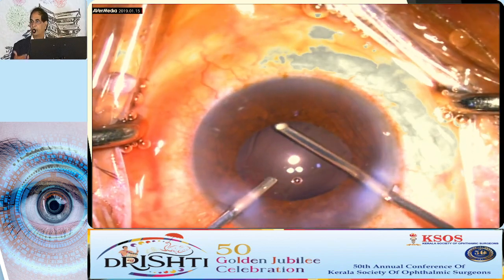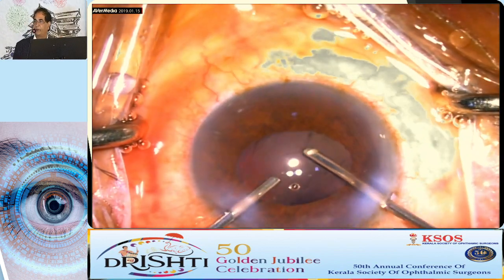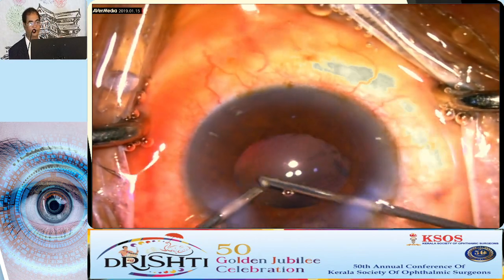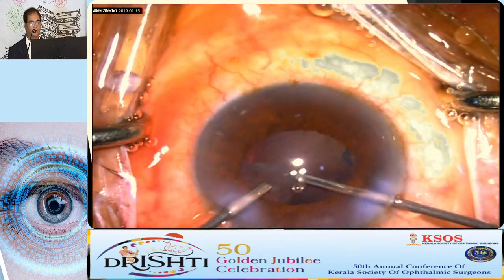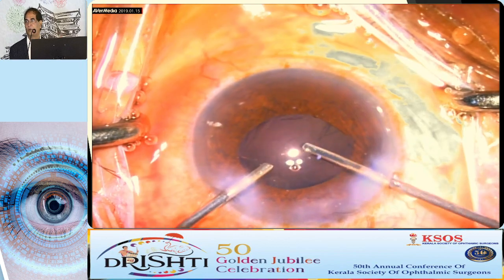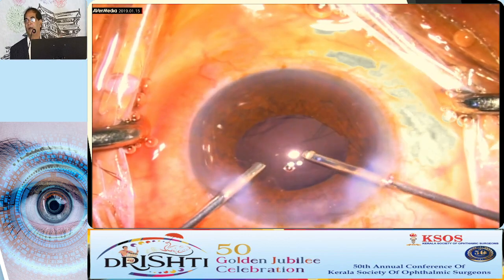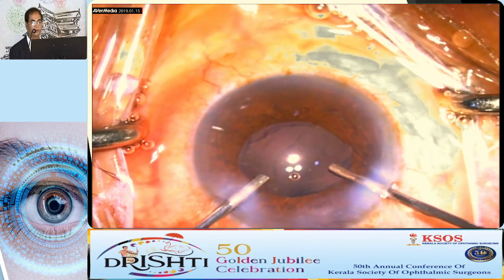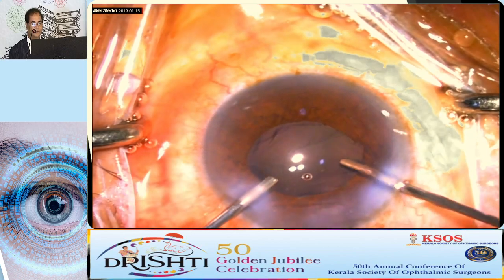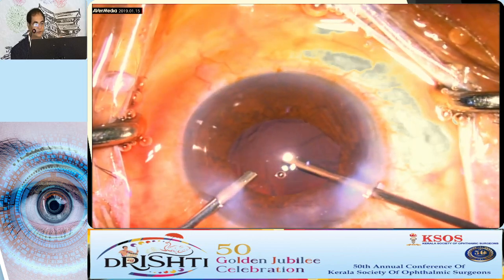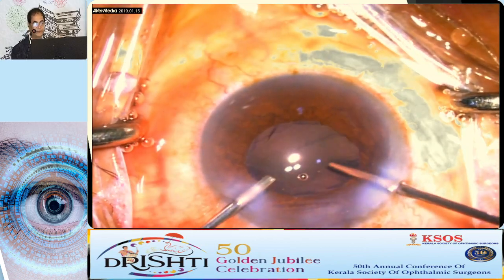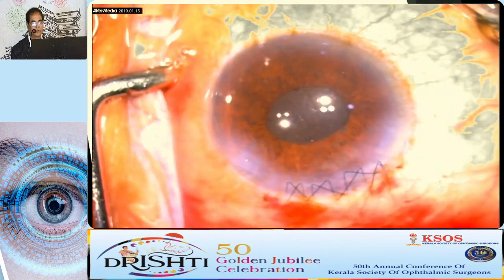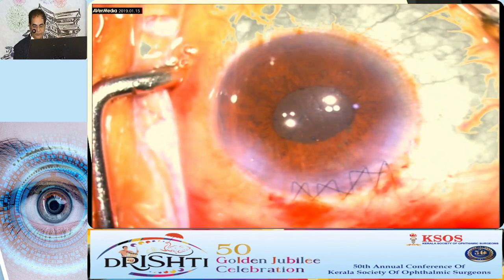Once you are thorough with vitrectomy, you can come back to IA cut mode. IA cut means aspiration comes first and the cut comes second, which helps you aspirate the cortex. I can aspirate the cortex and then give a cut, so you can remove the cortex this way. Because this was a SICS case, we implanted the lens in the sulcus and closed the case.